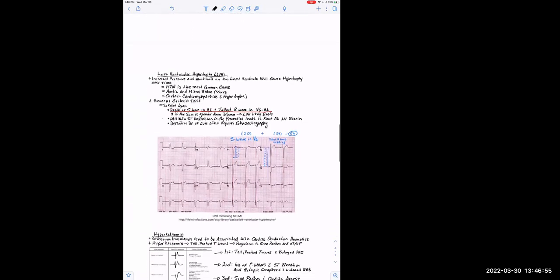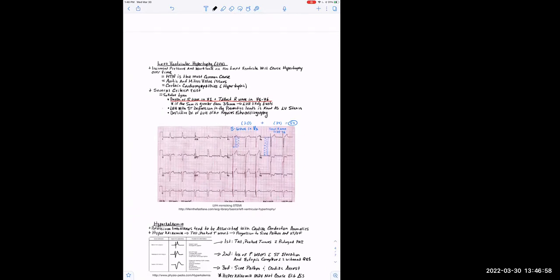No, that sounds great. And if you go back up and look at the ST segment changes, you'll also notice that there is some concave elevation there. And so that kind of continues this theme of concave ST elevation. Maybe I don't know exactly what's going on because there are lots of mimics, as you're beginning to see, but I see that this elevation just doesn't look like the classic ST elevation I'm used to seeing. Maybe I should think about one of the mimics.